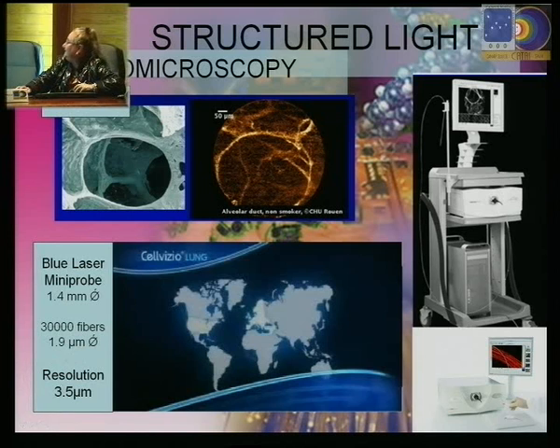But the coating is almost transparent and very thin, so therefore it looks like only one fiber, which in fact they have 30,000 fibers scanning the area.